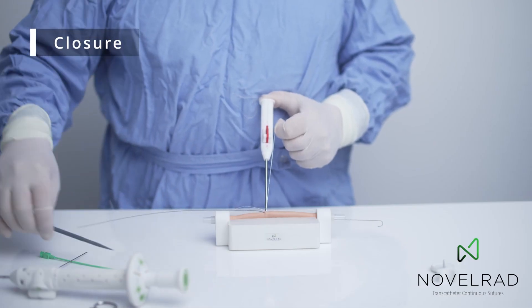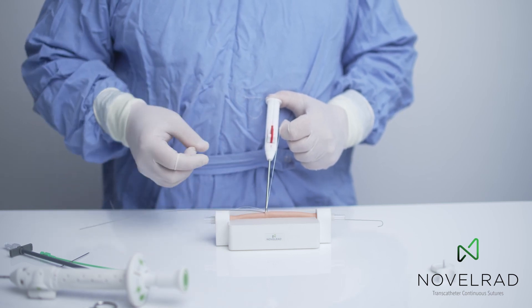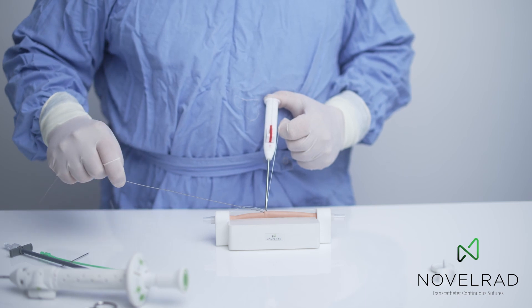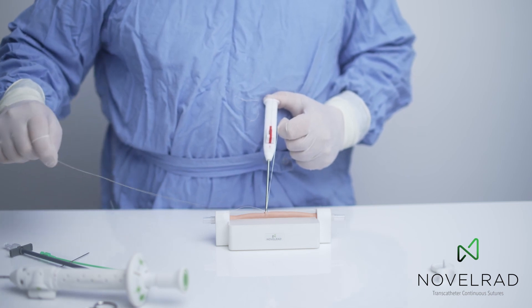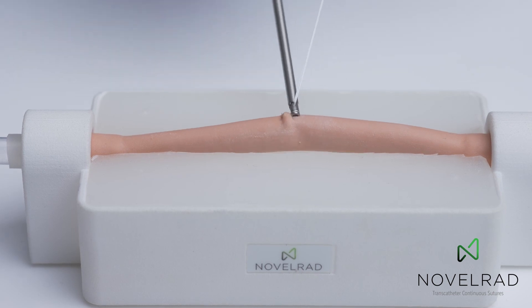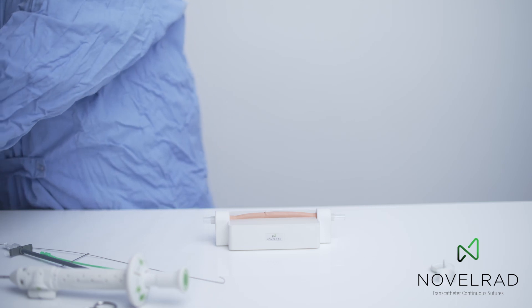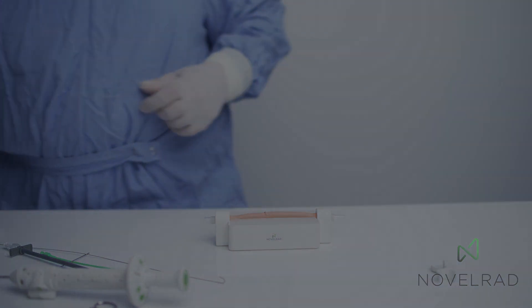The guide wire is still maintained inside. If there was arterial bleeding at this point, we could put another suture down. Then the guide wire is removed, and the suture gives us a final push on the knot pusher and the cutter, and it's cut with a little knife inside. And now there is a purse string suture.